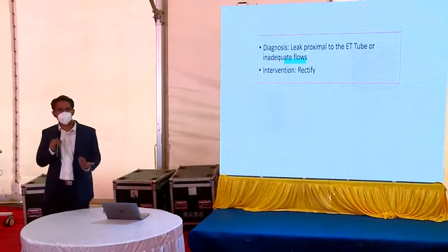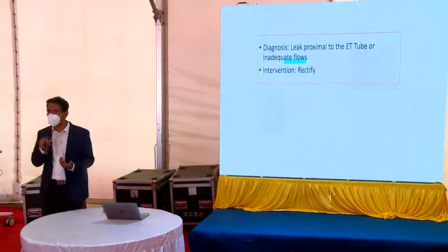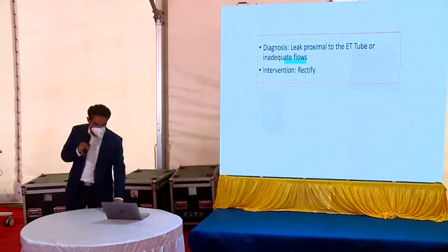So one of the most common sites of leak is where the tubes are connected to the humidifier. And also there is a knob where you open and put the fluid. So if it is not completely locked, then you will see this kind of a situation. Okay.